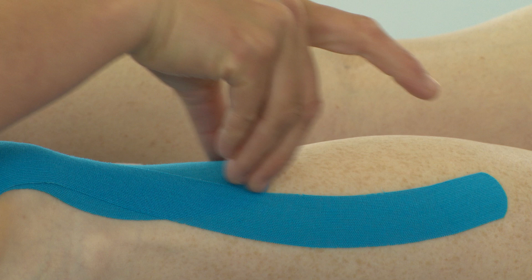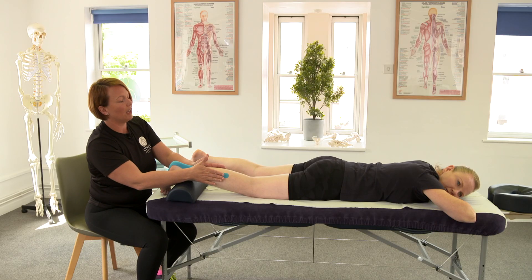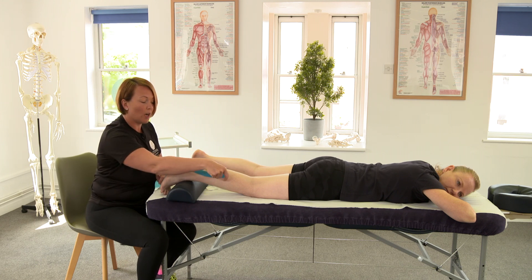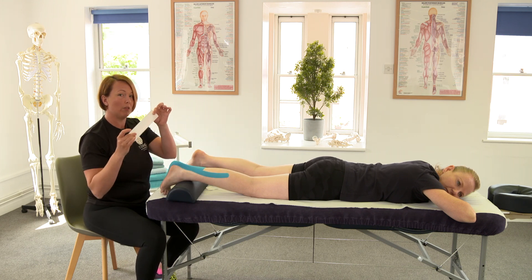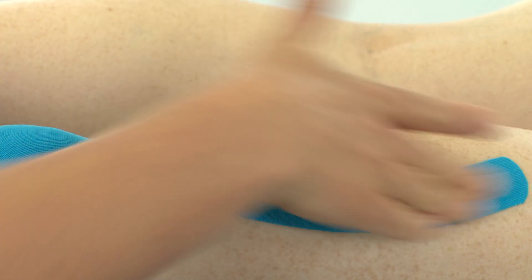So we've supported the soleus and the gastroc. If your client has a much wider leg you can use two eye strips so you wouldn't split them — you can use one for the medial and one for the lateral head of the gastroc.